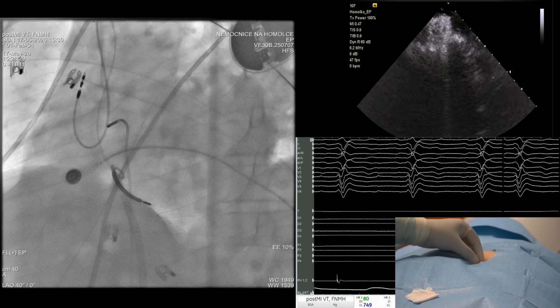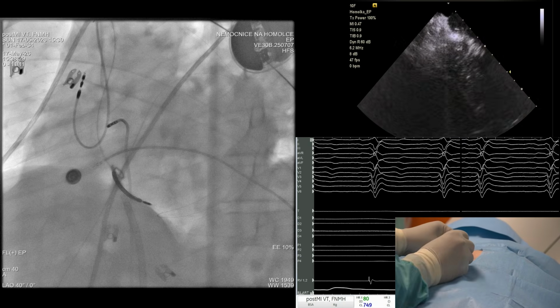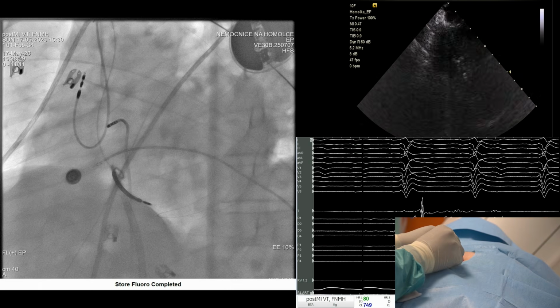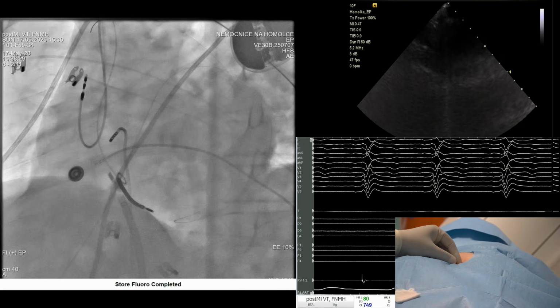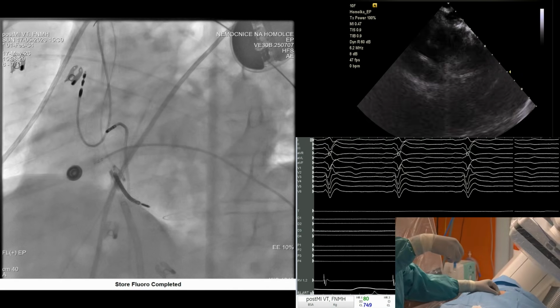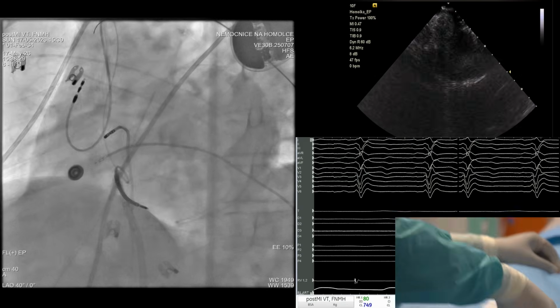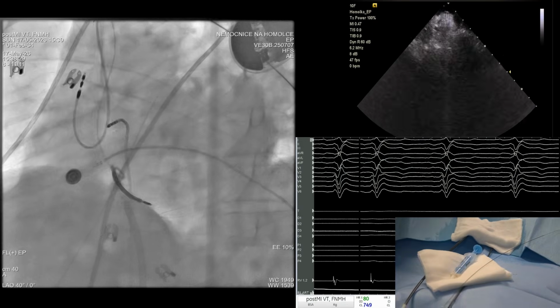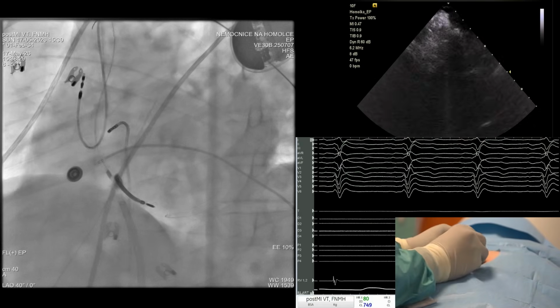Okay. Actually, you know what? I'll use this one. It's good. You're a small one. Okay, it's contrast. And I don't know if you can see it. Can they see this? Probably can't see it. Okay, here, I'll put it right here. You can try to look at that. Basically, it's fluid. So it's pericardial fluid, looks good. So that's just the access.